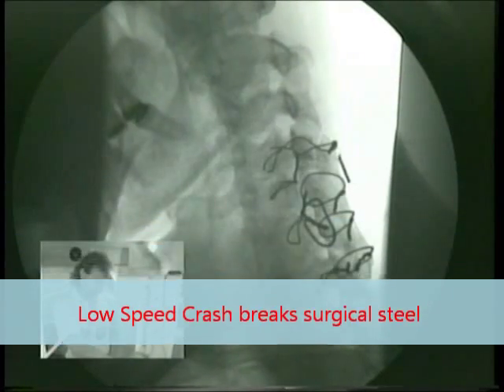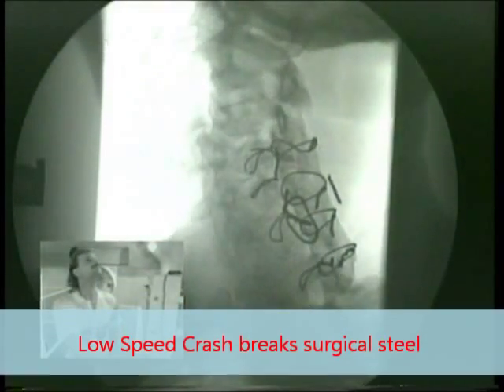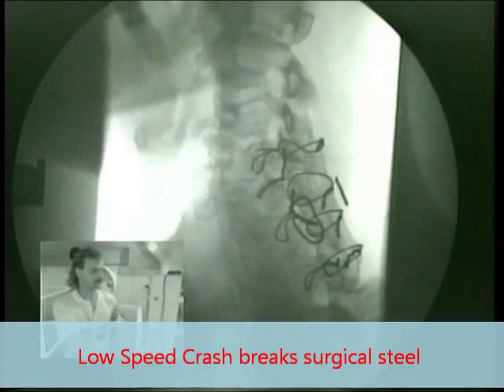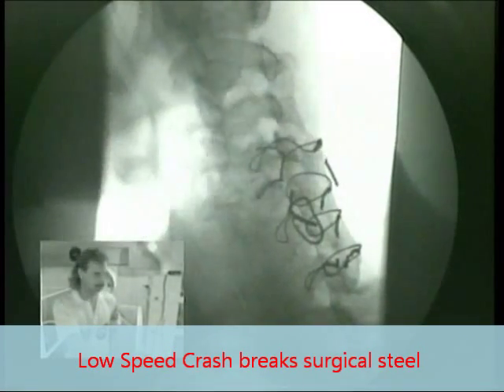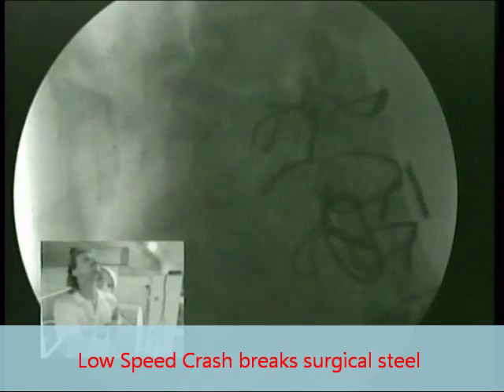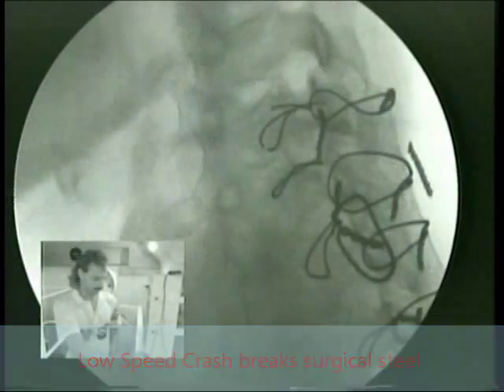This study shows five breaks in wires from a previous fusion surgery following a low-speed crash. These wires were 300-pound test titanium steel, and the orthopedist was extremely surprised that a low-speed crash caused this extent of damage to his fusion.